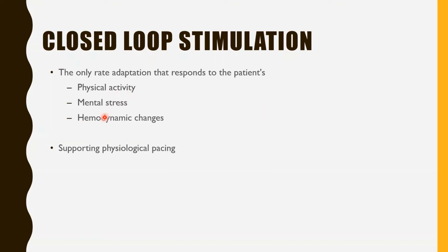mental stress. We know that in normal humans, whenever any mental stress comes in, the autonomic nervous system, which is of course the sympathetic, will overdrive the whole context itself. And you'll find that the patient's heart rate will go up, blood pressure will go up, and of course, needless to say, every sympathetic stimulation will go up at the same time. But unfortunately, if you have a patient with sinus nodal dysfunction, this is something that is lacking.